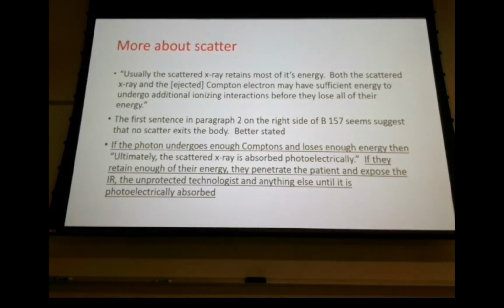So usually the scattered X-ray retains most of its energy, both the scattered X-ray and the ejected Compton electron. They still call it Compton, even though now we're talking about an electron and not a photon. Both have sufficient energy to go on and further ionize different atoms.